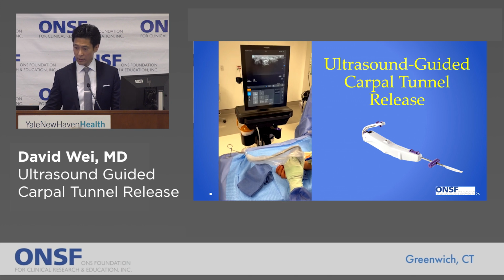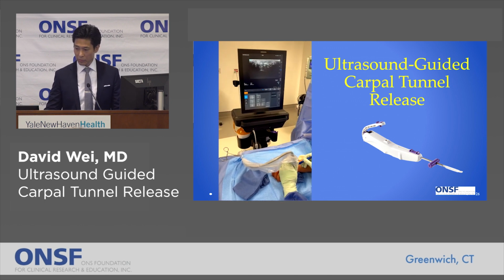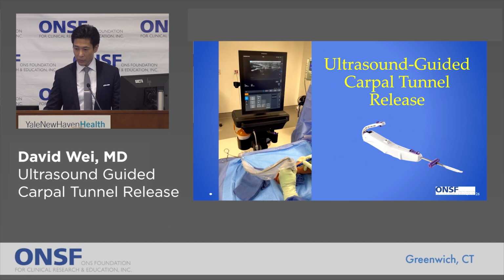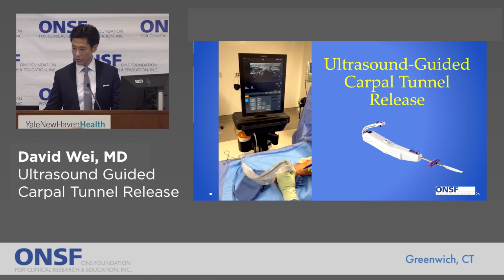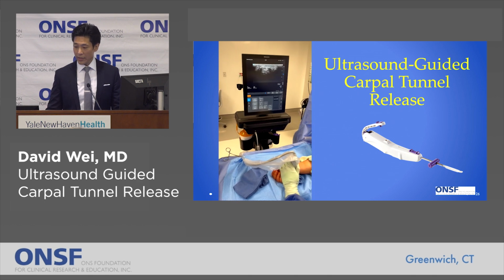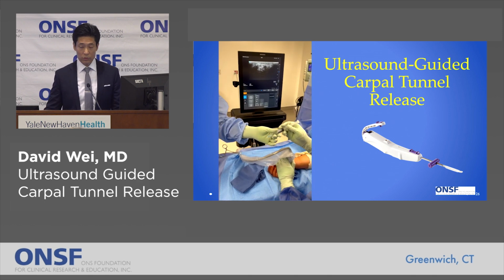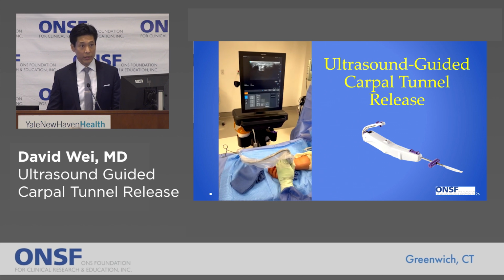I can see the way that it splits distally into digital common nerves. And I'm using some landmarks here. But the reason why this has become a very interesting and perhaps better solution for me is that it lets me use this other tool. This tool allows us to make an even smaller incision on the wrist that is so small you actually don't even need sutures to close it.